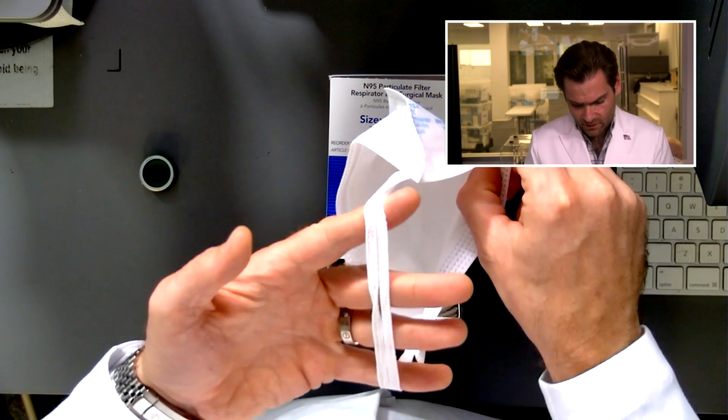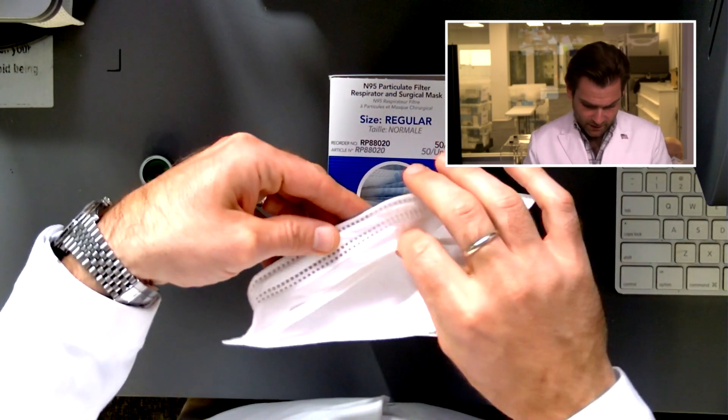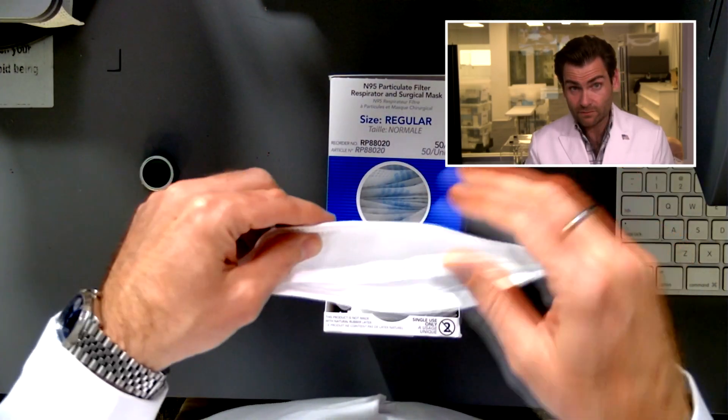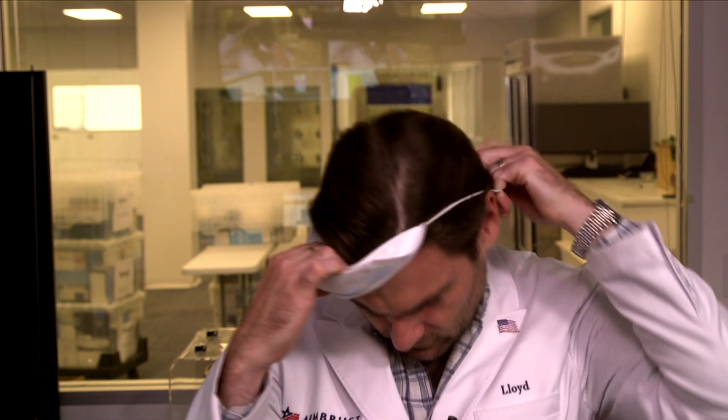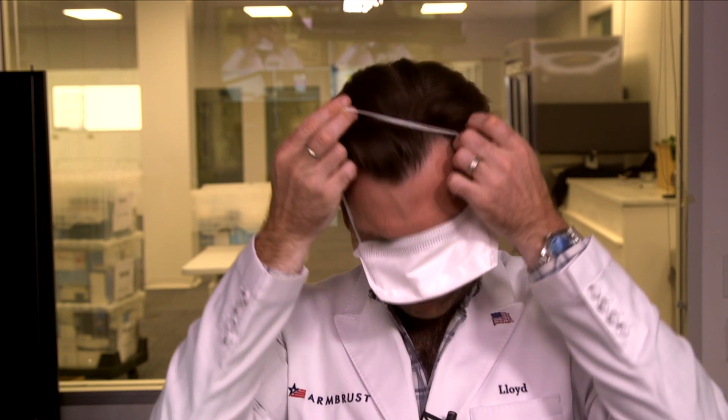We bought a ton of them and they're on our website for you to purchase if you want to try this out. Let's look at the style of the mask. Pulling it out of the box — it's got a head strap like all N95s, and it has this huge nose wire that goes all the way across, giving you a nice seal on the top. To put it on, you want to go over the back of the neck first, and then you find your other strap.